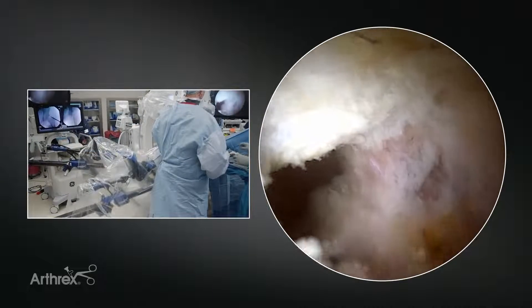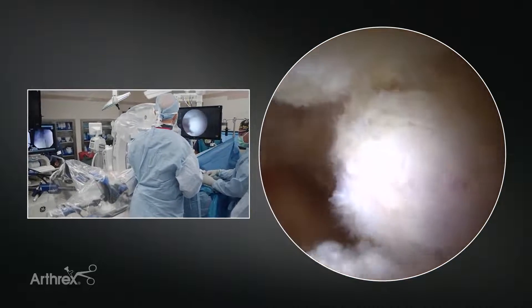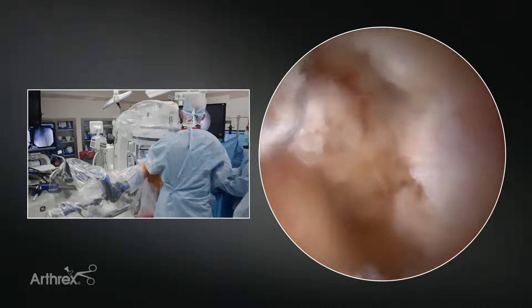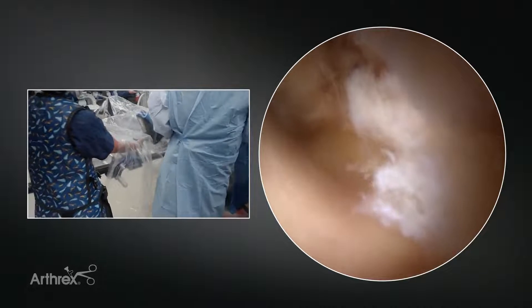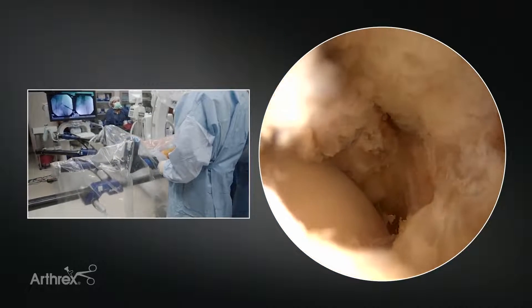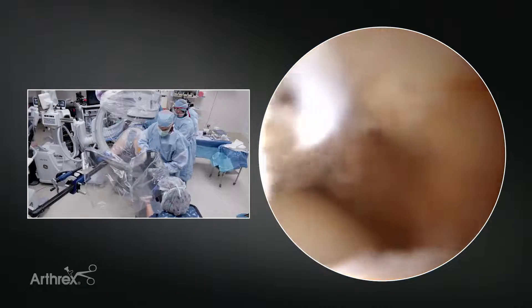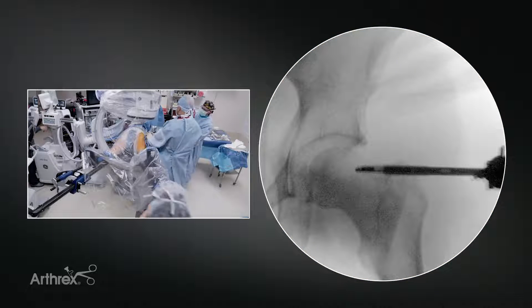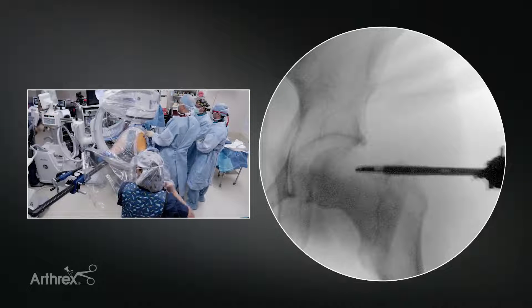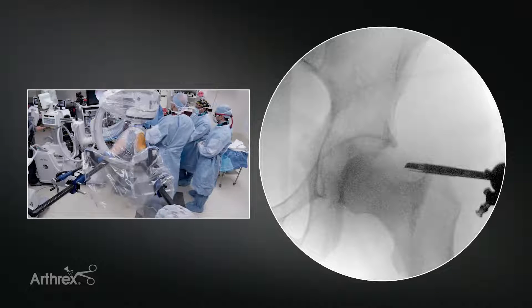We've completed our femoroplasty and put in three stitches to close the bottom of the T with the hip out of traction and flexed. Now we're going to reapply traction to allow better access for capsule closure in the interportal capsulotomy. We stabilize the pelvis, tilt the bed back away from us, and apply a gentle inline traction. We can put some fine traction on now. We've reapplied traction to help give us access to the capsule for placing our stitches, so we can place our superior stitches without hitting the head or the rim.